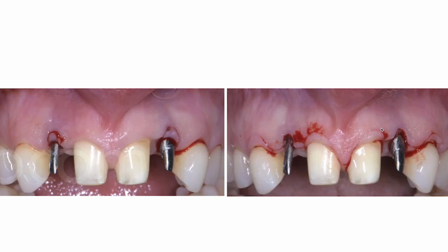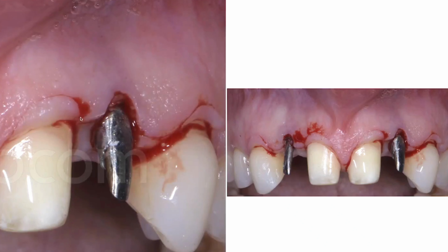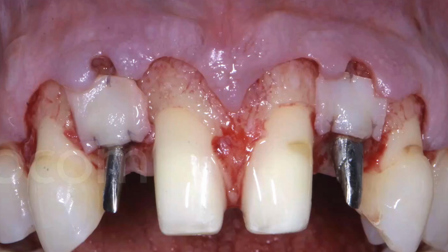Surgically means we can make a submarginal incision at the level of the implant site to create a longer papilla. So submarginal incision at the abutment of the implant. This makes this papilla longer, and thanks to the advancement of the flap, this longer papilla can reach the palatal aspect and close everything by first intention, provided that the increase in the thickness of this papilla is guaranteed by the connective tissue graft. So connective tissue graft at the level of the implant to mask the transparency.